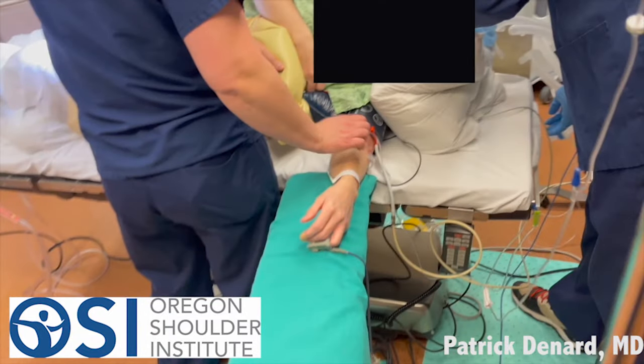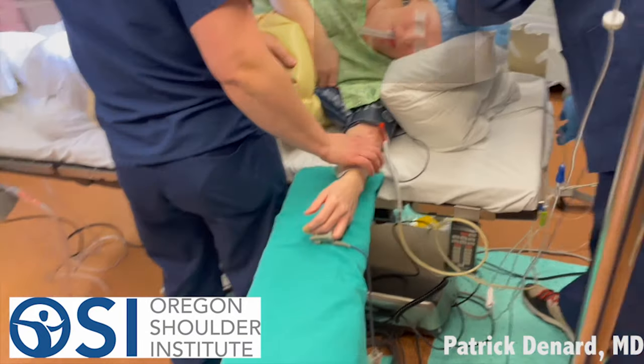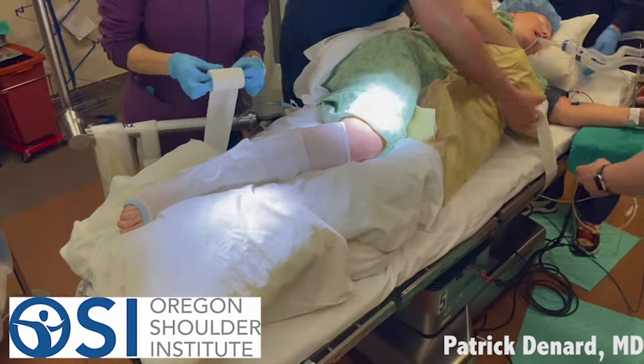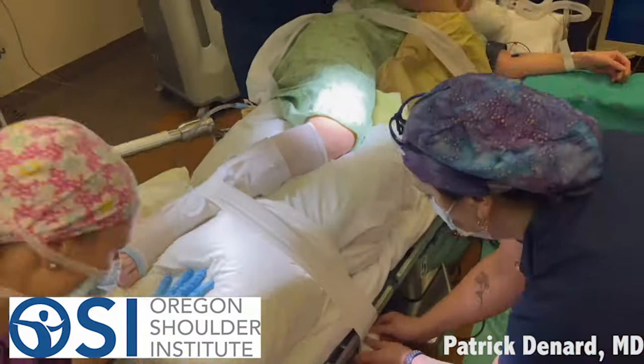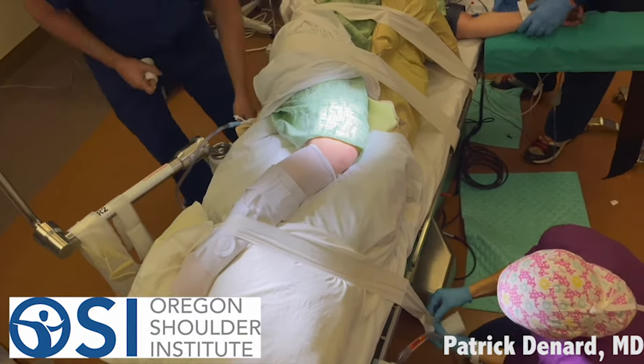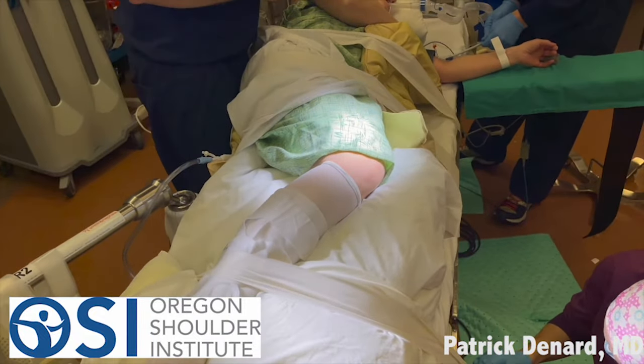The beanbag is inflated. That keeps the position, and then the down arm — in this case we'll work on the right arm — the left arm is out to the side. It's a pretty comfortable position. We use a little tape to secure in addition to the beanbag so that there's no movement. We make sure that none of the nerves are pinched as we're applying this tape, and this gives us good security so we can work on the shoulder.